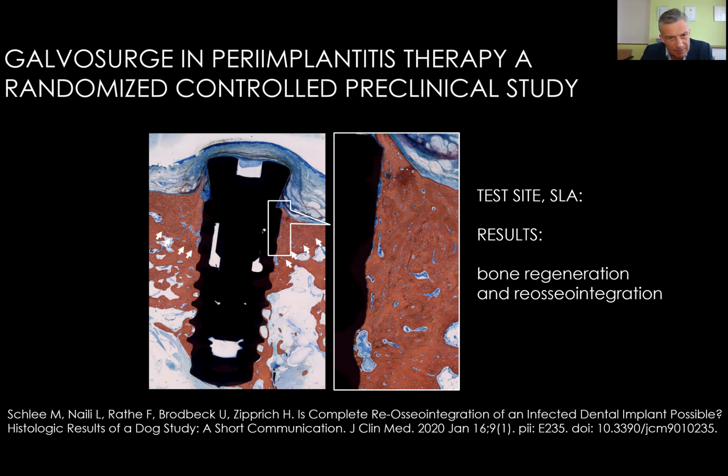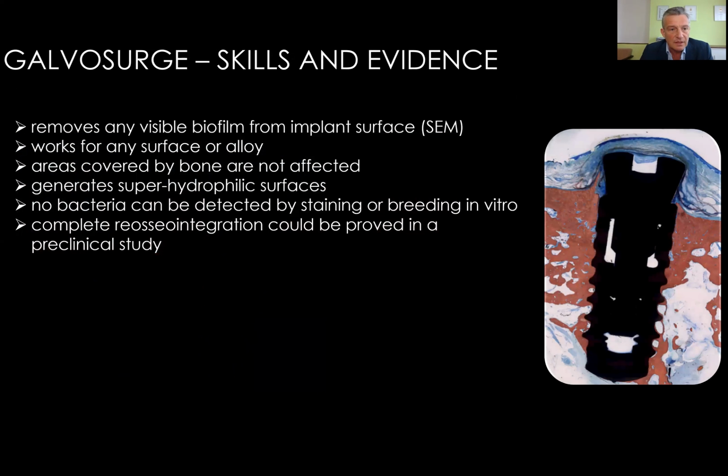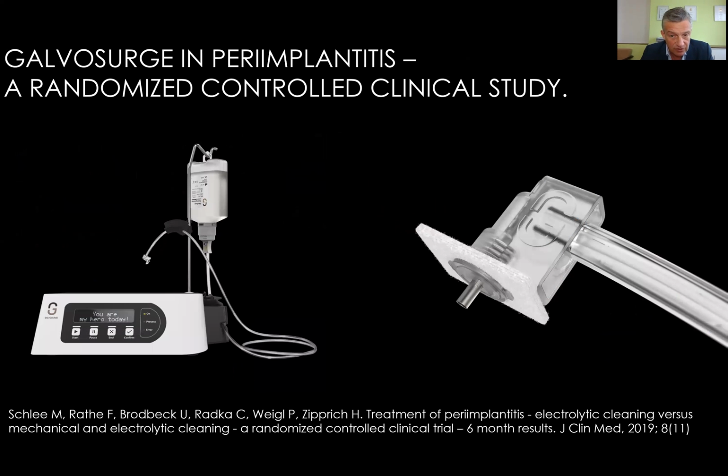Finally, I was not very happy with that study because we had a lot of exposures. I told those dogs that they should not bite on these freshly operated areas, but obviously they did not follow. So we had to deal with a high number of exposures, which limited, of course, the statistical analysis of the study. So we just reported some evident differences, but we were not able to prove significant changes. But again, I guess this was the first time that a complete re-osseointegration could be reported. So again, this was the conclusion. I never saw any complete re-osseointegration before.